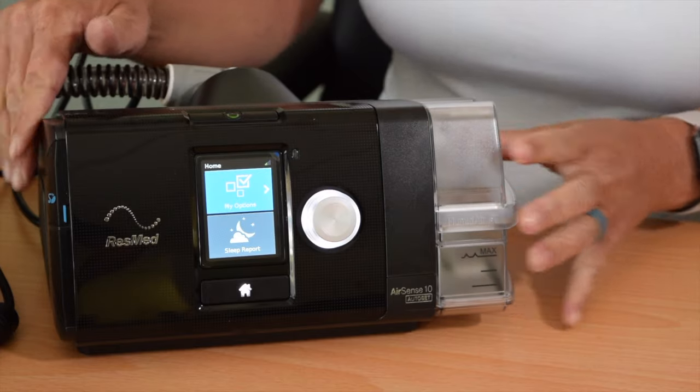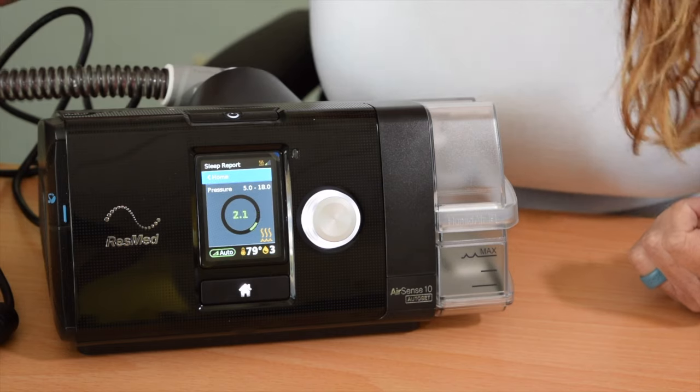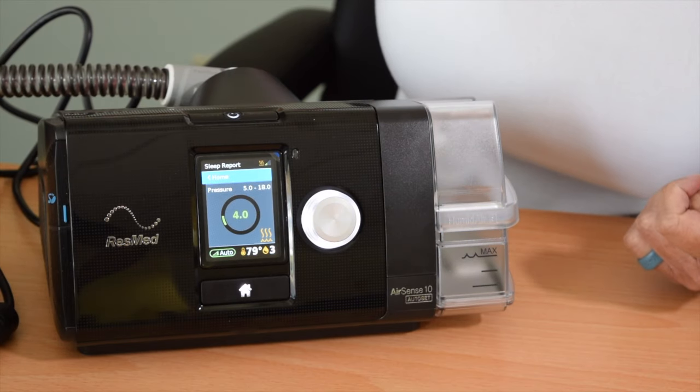The water chamber wasn't in all the way. I'm going to make sure it's in all the way, and then I should be able to turn my CPAP on and it's going to run normally.